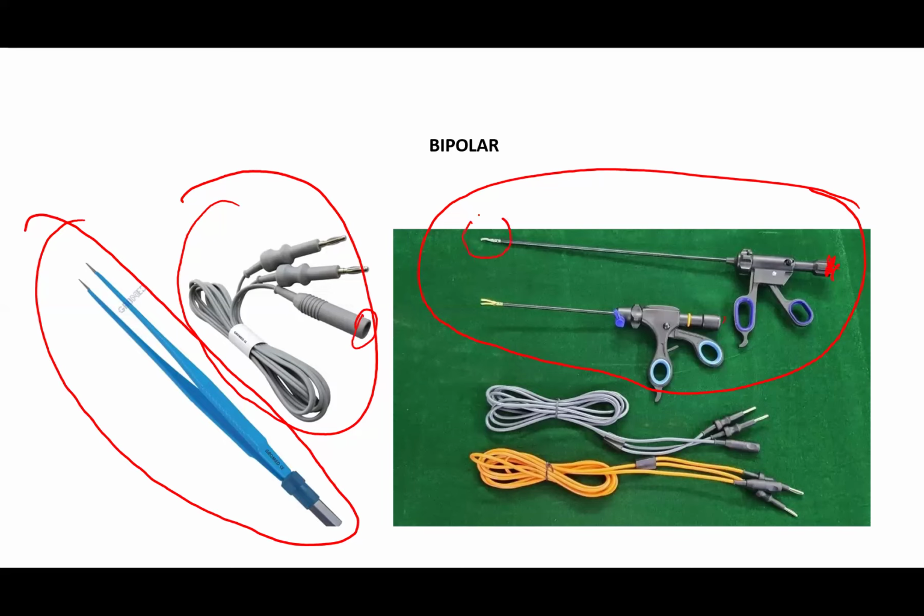Now, the tips can take the blade of a Maryland or a grasper. There are different types of blades that may come with it, but you should know how a bipolar forceps looks. This is how a bipolar forceps looks for a laparoscopic procedure.